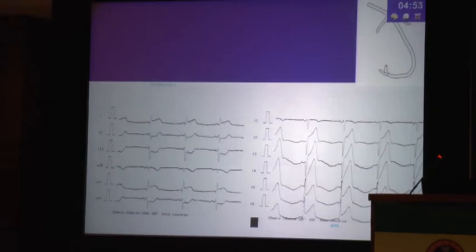Now, if you look at this ECG, it depicts to you ST elevation. There is no ST elevation in lead V1, there is no ST elevation in AVR, so you can almost diagnose that this axis is moving laterally. The ST axis is moving laterally. It's not going upward. So we are not having ST elevation in the upper leads, in lead V1, in lead AVR, which are most sinister, bad prognostic signs in the patient. But you may have, of course, ST elevation in V1, V2, V3. That's why you diagnose it as an anterior wall infarct. But what we have is a lateral upward axis of the ST segment.